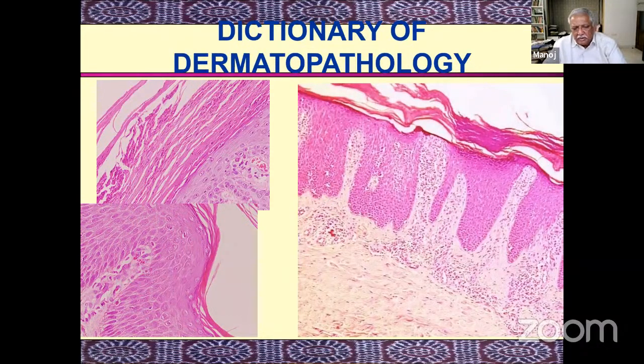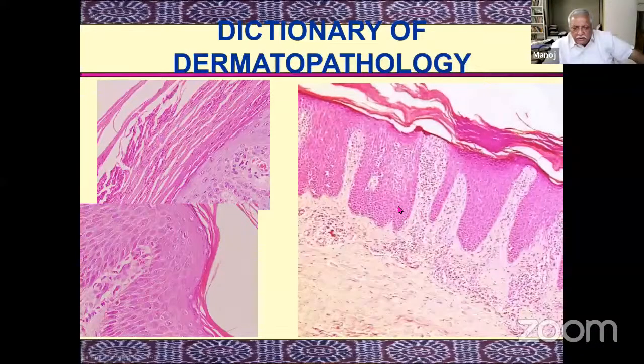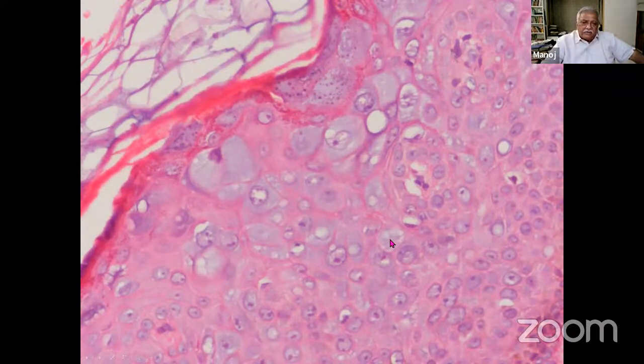A higher power of what we have seen already. Irregular spongiosis, irregular hyperkeratosis, this spongiosis. At times, a dermatopathologist gets terribly excited because you see the color of these cells. These are all pink because of the hyaline. These are all pink. All of a sudden, you will suspect that some of the cells in the epidermis are not pink, they are blue.